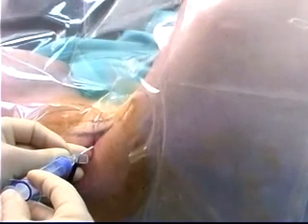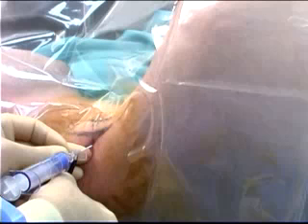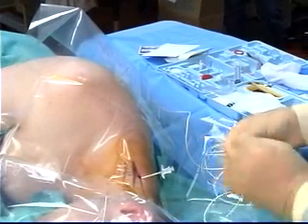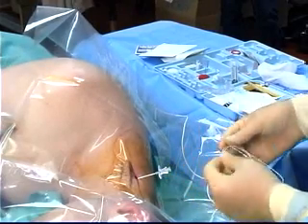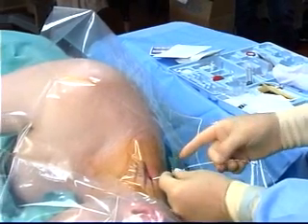The tip of the needle is now situated between the anterior and middle scalene muscles and is in contact with the C6 root of the brachial plexus. The nerve stimulator is now removed from the needle and attached to the proximal end of the stimulating catheter, and the tip of the catheter is inserted into the needle shaft.